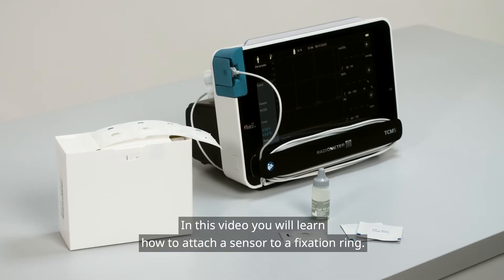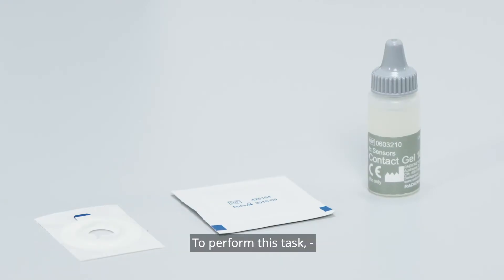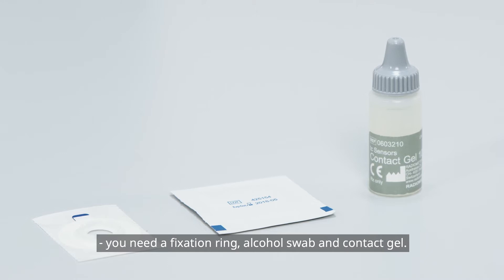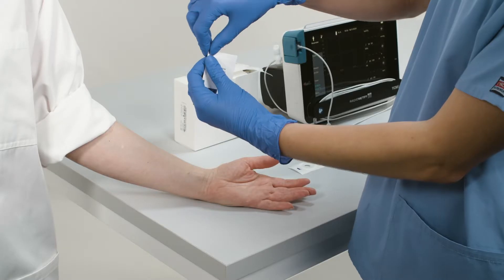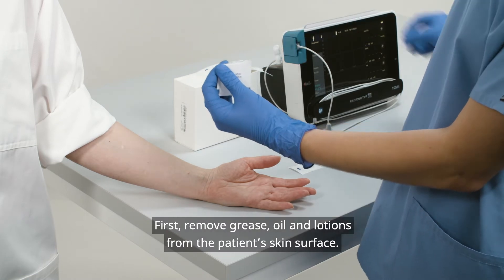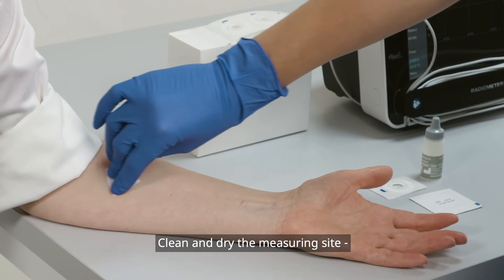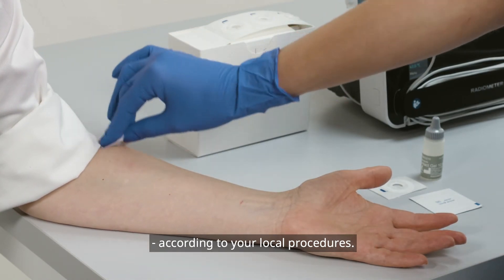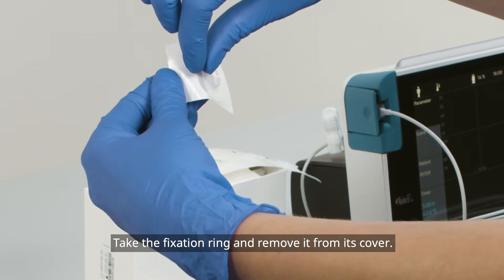In this video you will learn how to attach a sensor to a fixation ring. To perform this task you need a fixation ring, alcohol swab, and contact gel. First, remove grease, oil, and lotions from the patient's skin surface. Clean and dry the measuring site according to your local procedures.